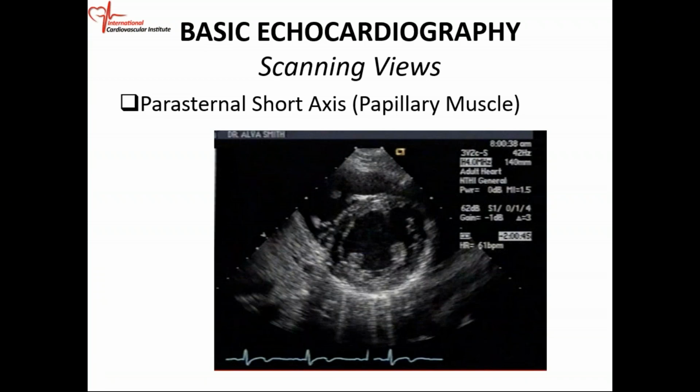These are small, minuscule movements. Okay, nothing abrupt. So this is short axis at the level of the papillary muscles. These little humps are papillary muscles. Previous position, you had the mitral valve. You're moving the transducer angle further upwards now, so you get short axis at the level of the papillary muscles.